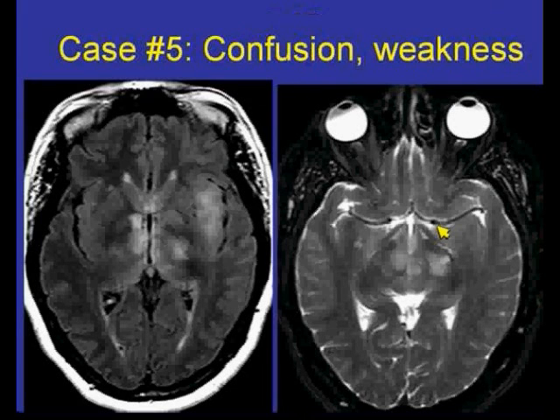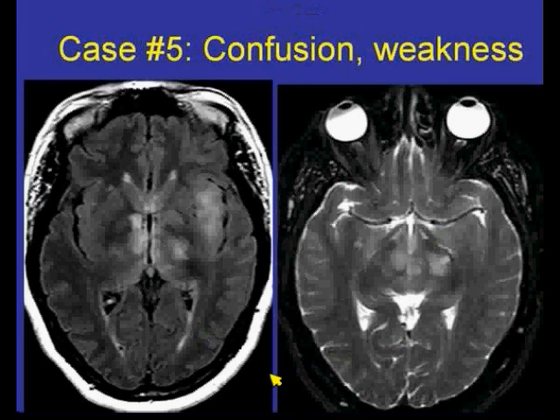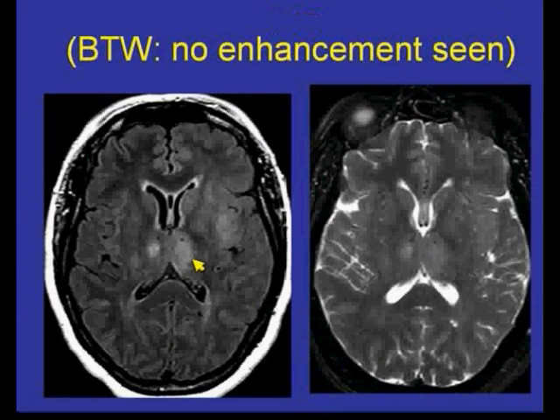A young individual who had confusion as well as weakness after a viral illness. You're seeing the FLAIR scan on the left and a T2-weighted scan on the right. Another example of the FLAIR scan and the T2-weighted scan in this individual — there was no enhancement seen on the post-gadolinium enhanced scans. Once again, this occurred after a viral illness.